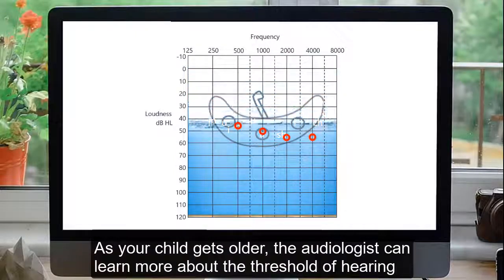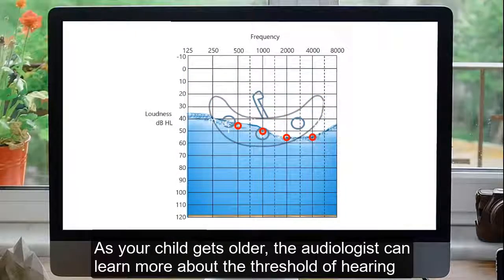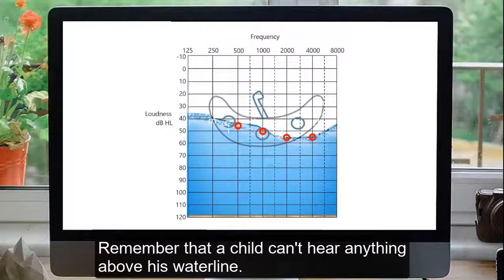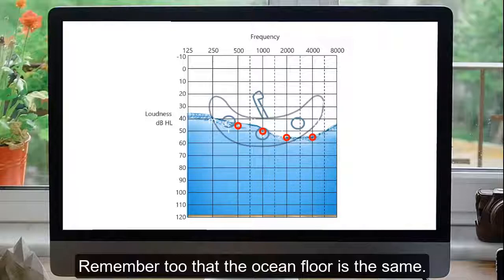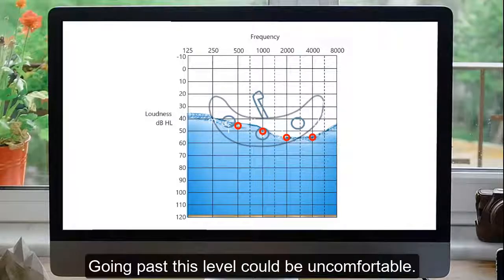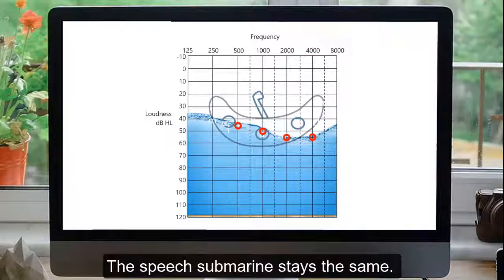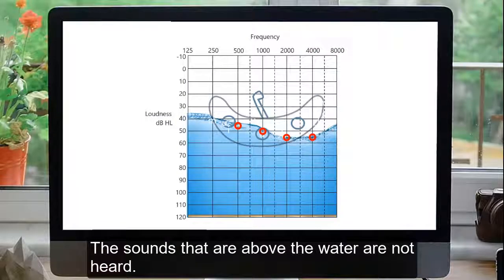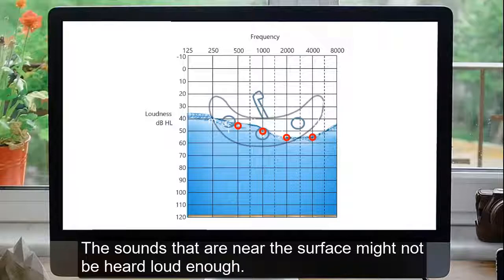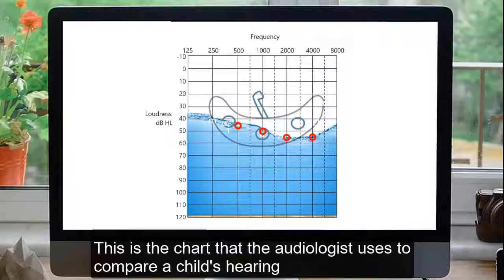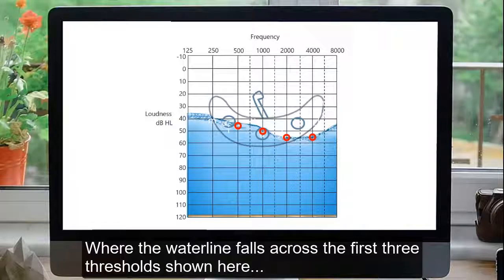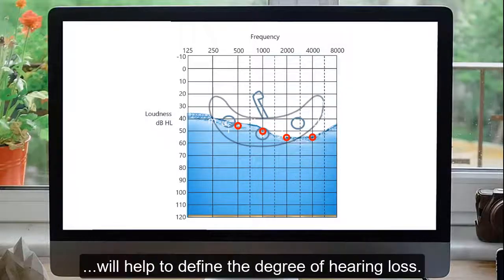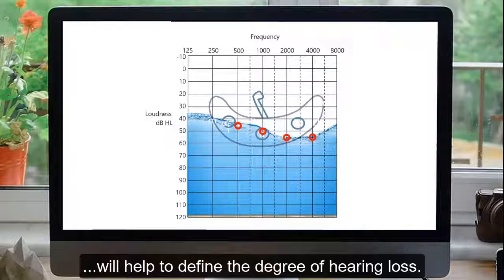As your child gets older, the audiologist can learn more about the thresholds of hearing for each frequency on the audiogram. Remember that a child can't hear anything above his waterline. Remember, too, that the ocean floor is the same. Going past this level could be uncomfortable. The speech submarine stays the same. The sounds that are above the water are not heard. The sounds that are near the surface might not be heard loud enough. This is the chart that the audiologist uses to compare a child's hearing to what most people can hear.